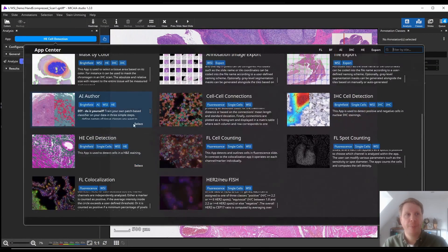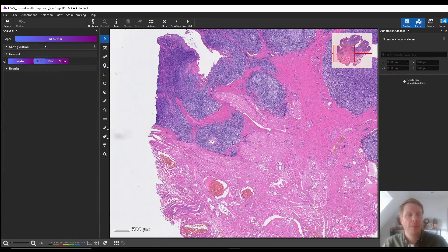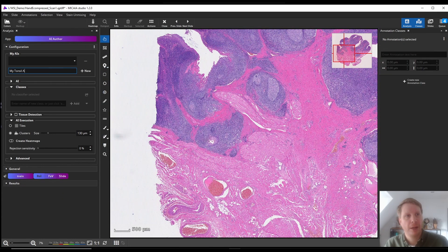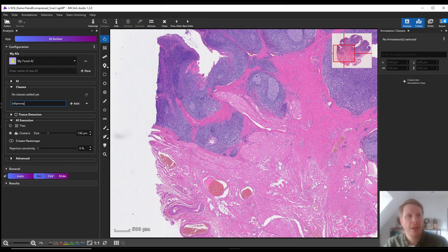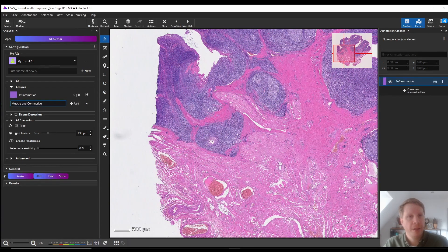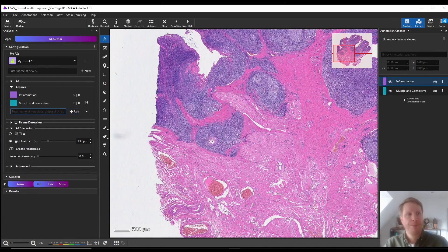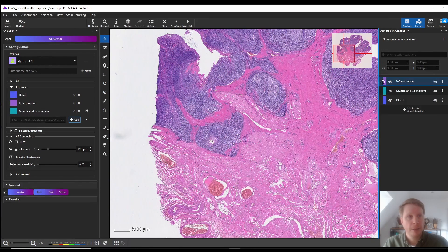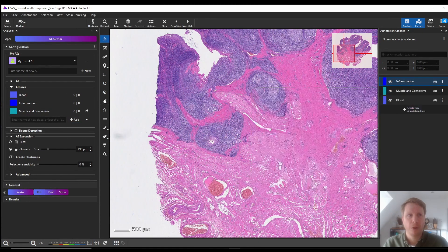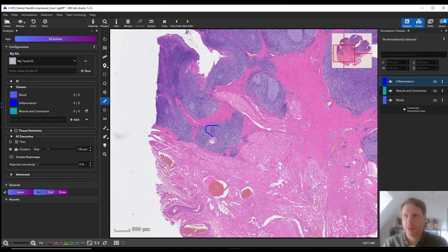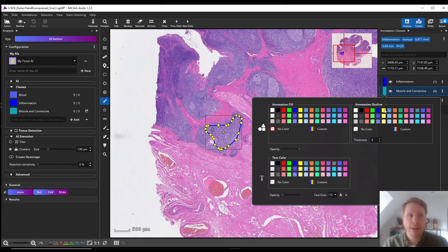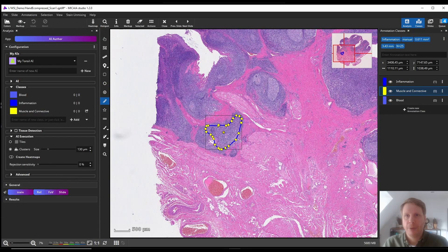You can see how I already selected the app in the App Center and now I'm sort of like an editor. I create a new AI, assign a name — here my tonsil AI — and now I'm adding three classes, because what I want to do is train the AI to recognize three tissue types: blood, inflammation, and muscle and connective tissue. Here I'm assigning a different color for each class and now I have to create some training annotations.